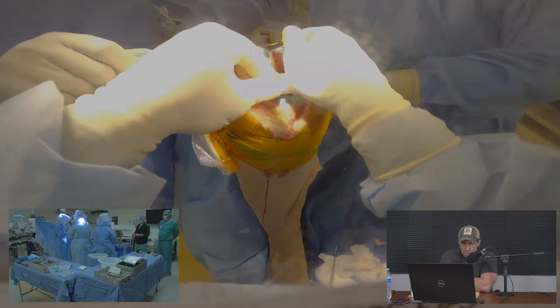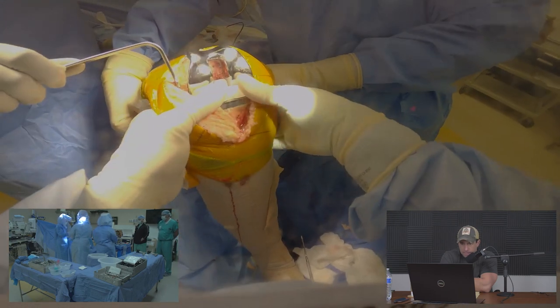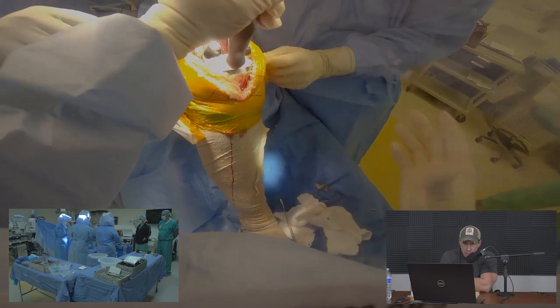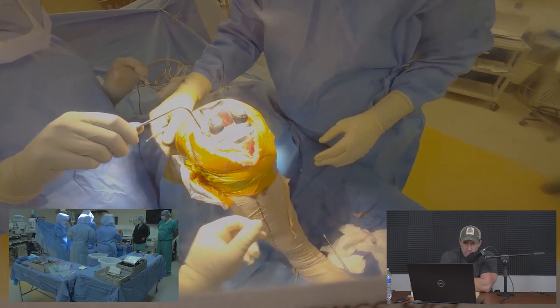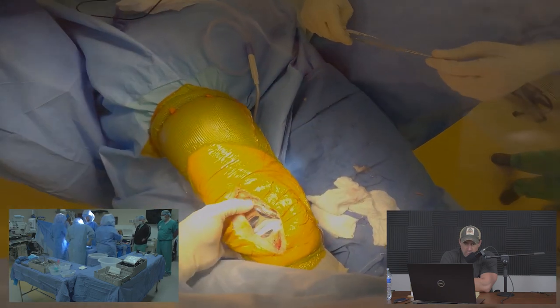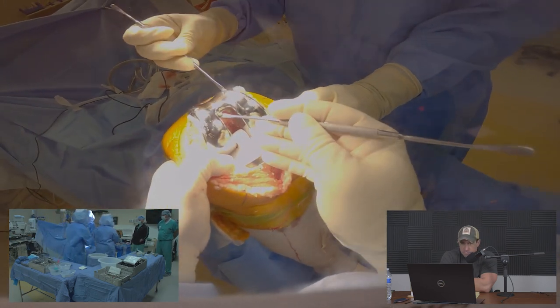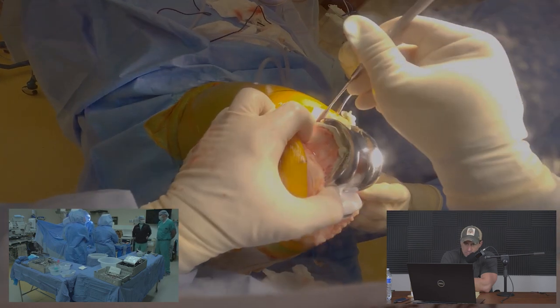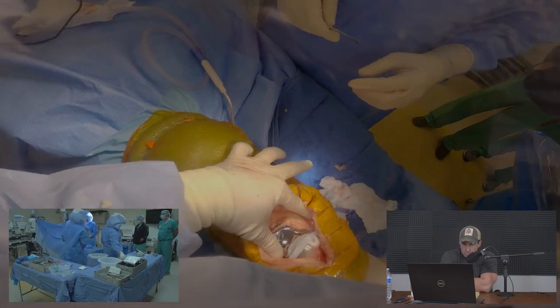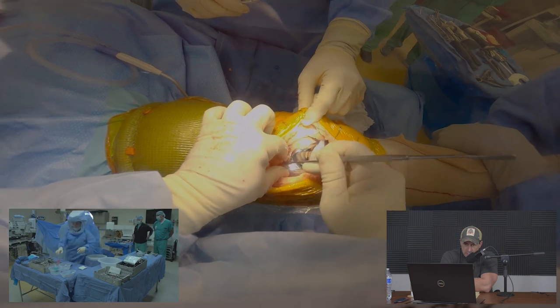The polyethylene insert is made to sit down within the tibial tray. Once nearly into position, soft tissues are moved aside and an impactor locks it in. We pressurize the knee in full extension to push out any excess cement, which is then removed from the top part of the knee.